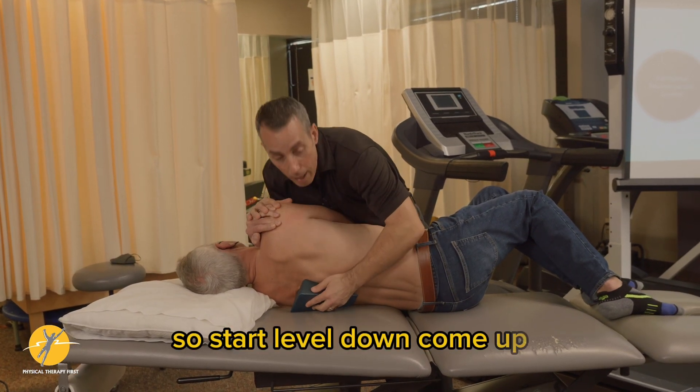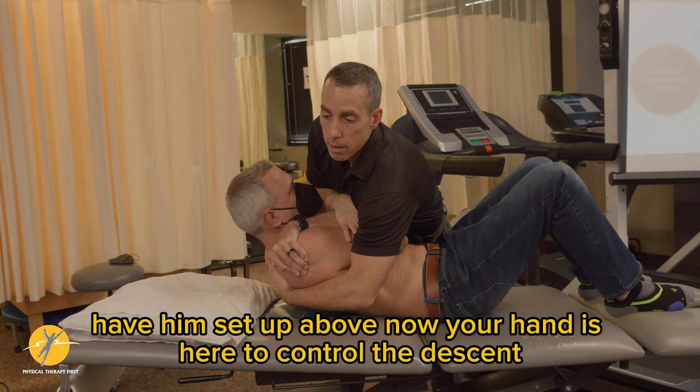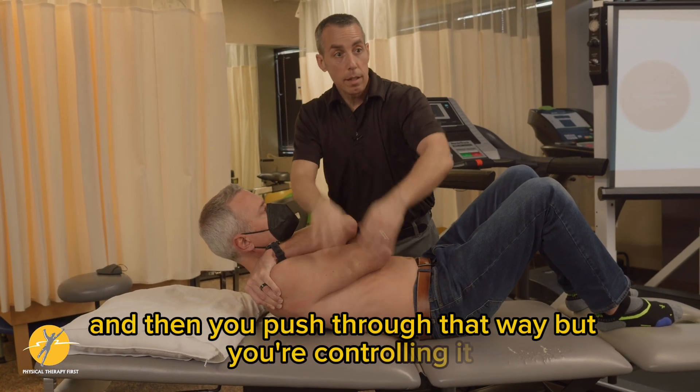Start a level down, come up, have him sit up above. Now your hand is here to control the descent. Take a breath in and out, and then you push through that way — but you're controlling it.